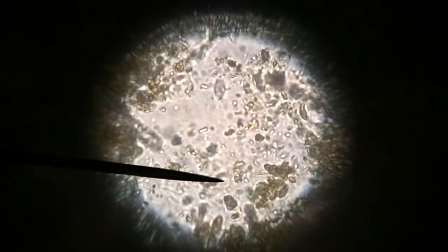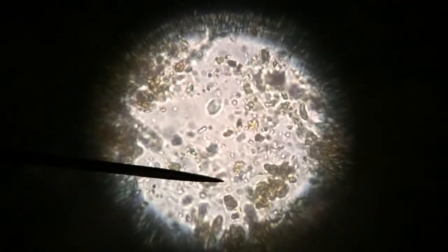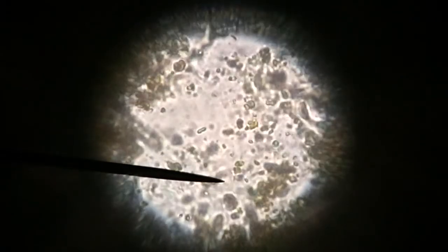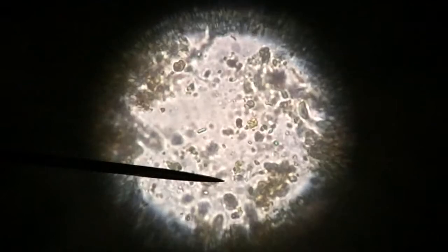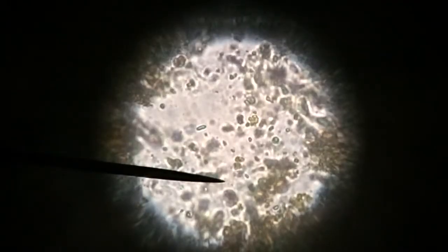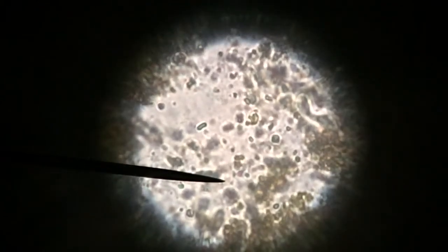I cannot focus. When I get this on a bigger screen I'll be able to tell better. That's what's actually causing this turtle's problem, or one of them. We have a cytology to do in just a second. Our buddy actually has several different protozoa in the stool.